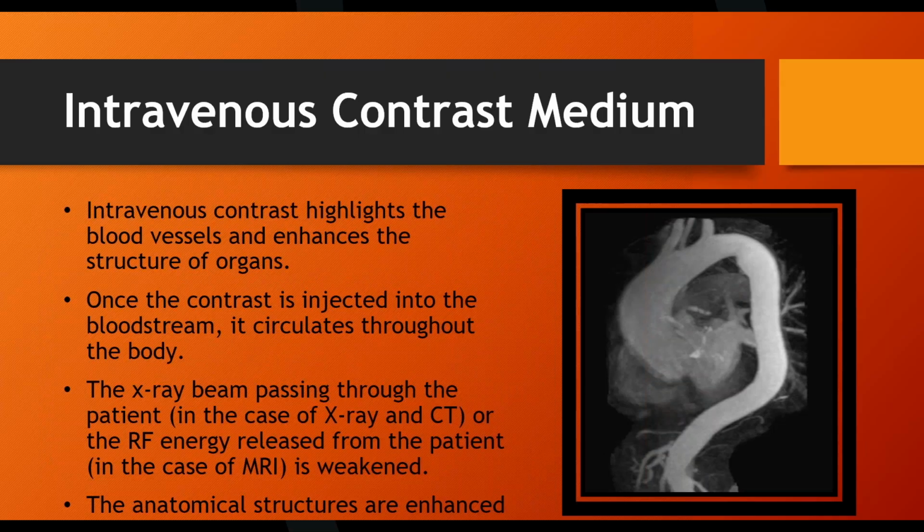This is a smaller, less dense object, but this is an X-ray image. Because the aorta currently has the contrast fluid in it, the X-rays aren't passing through the skinnier body part, whereas in the background you can barely make out the heart because it doesn't have contrast in it at this particular moment. So the X-rays are passing through it and basically blacking it out, making the blood vessel show up much brighter.